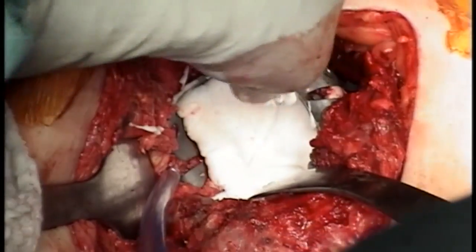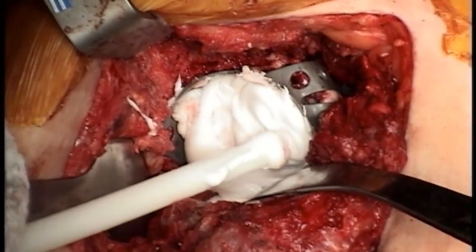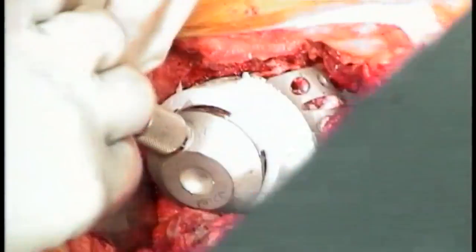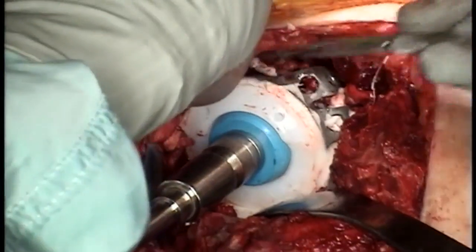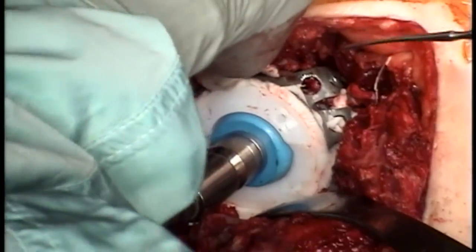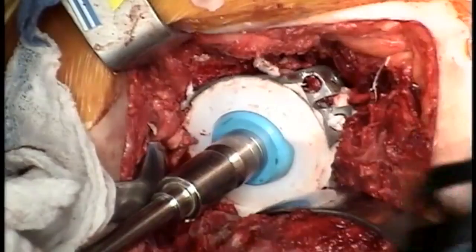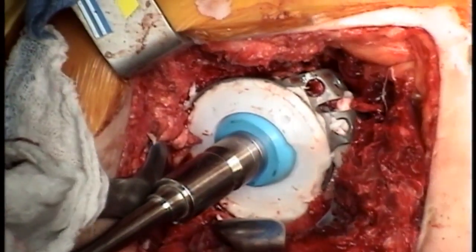We want to try to avoid cement going into the surrounding tissues. After we have cement around the cup, we are ready to implant the polyethylene. We will now see sequential videos showing us holding the proper position of the polyethylene while allowing the cement to dry, making sure to remove any excess cement to prevent external impingement and third body wear.